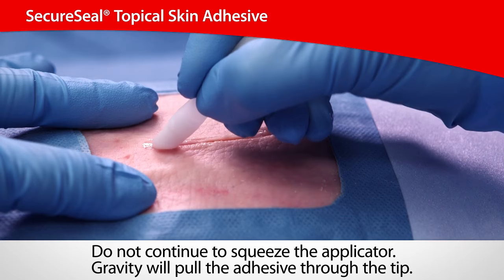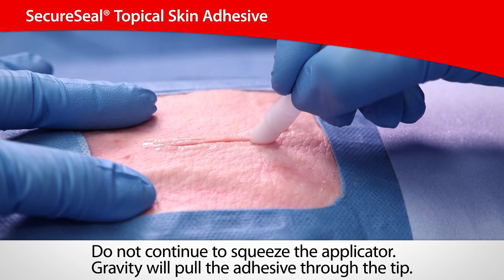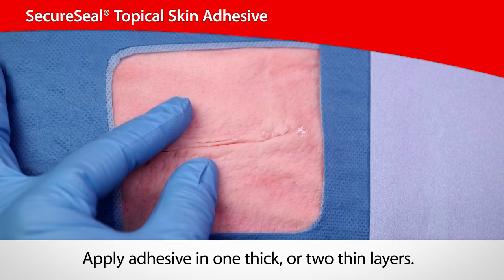Ensure that the wound is clean and dry. Oppose skin edges. Gently glide the applicator tip against the wound to spread the adhesive evenly.